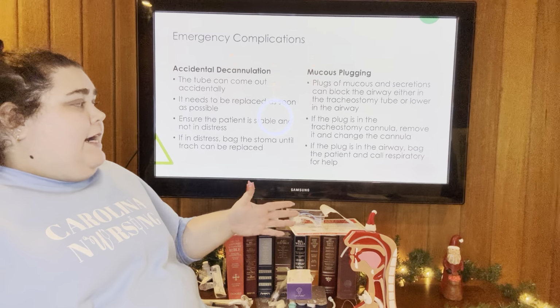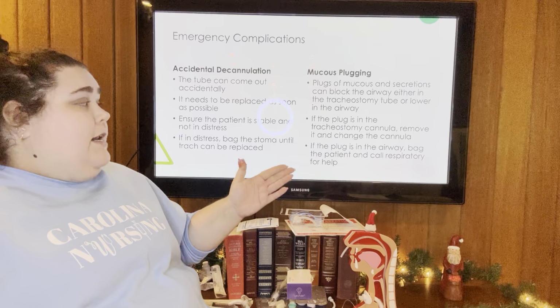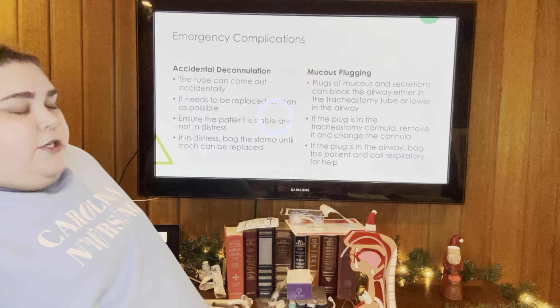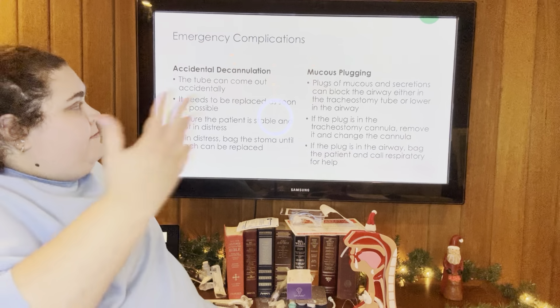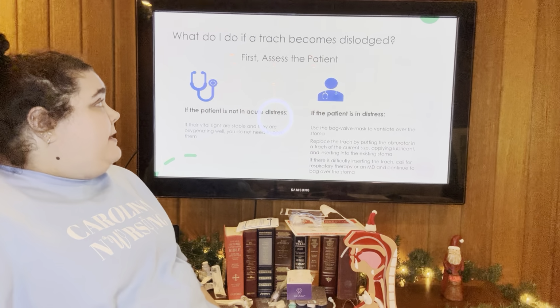If the plug is in the airway and you can't get it out and the patient is in distress, then bag the patient and call for the respiratory help. Sometimes just bagging the patient also can help kind of get the mucus plug out and kind of push it along. So what do I do if the trach becomes dislodged?